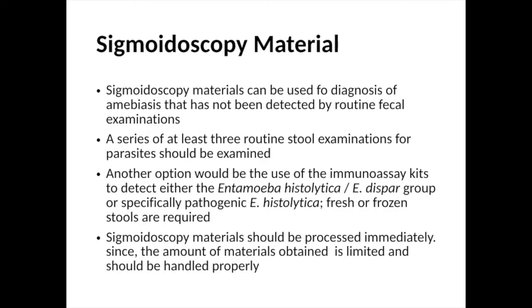Sometimes, in cases of amebiasis, it has not been possible to detect the disease by the classical and routine fecal examination. In this case, sigmoidoscopy material should be a good choice. These materials should be handled and processed immediately since they are very little and should be handled properly.